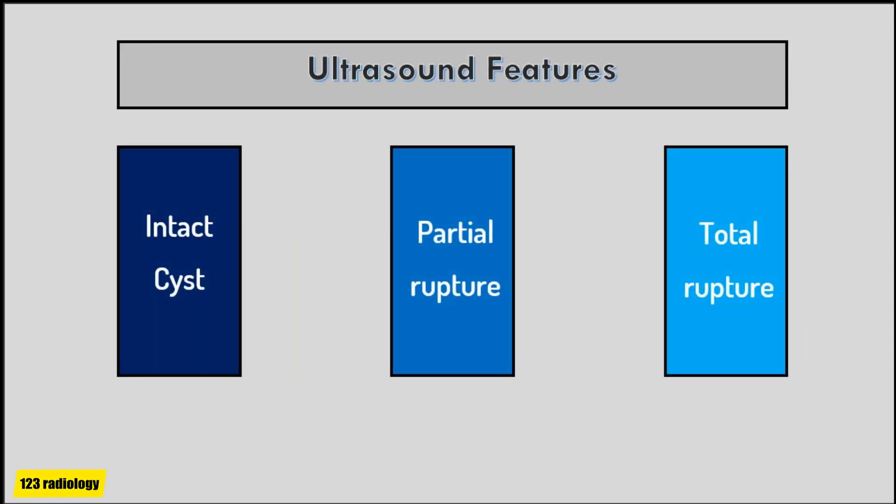Ultrasound appearance depends on the maturation of the cyst and the amount and compactness of keratin, as well as the presence of cyst rupture and degree of cyst collapse. Ultrasound appearance can be divided into three categories: intact cyst, partially ruptured cyst, and totally ruptured cyst.